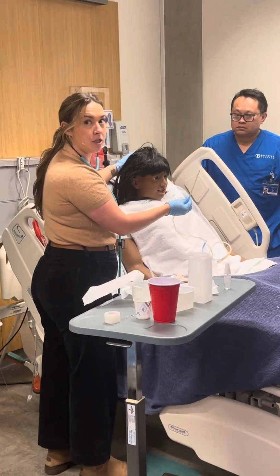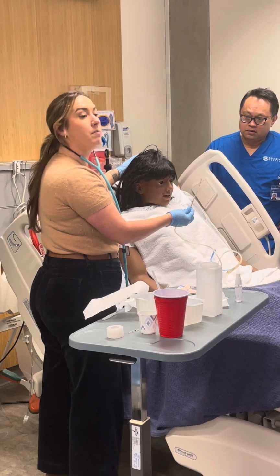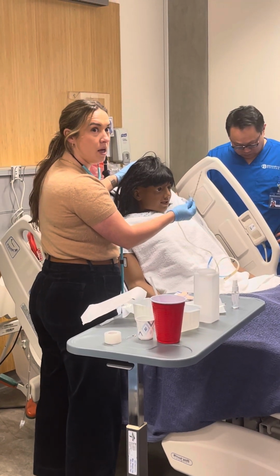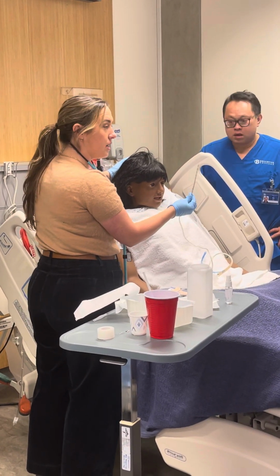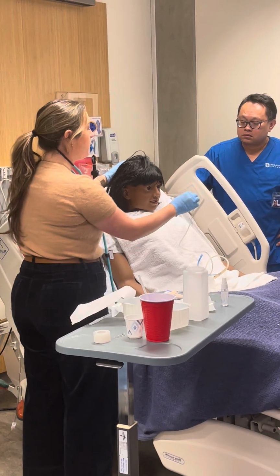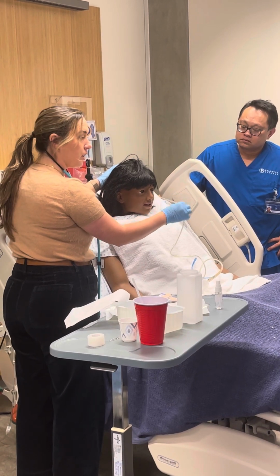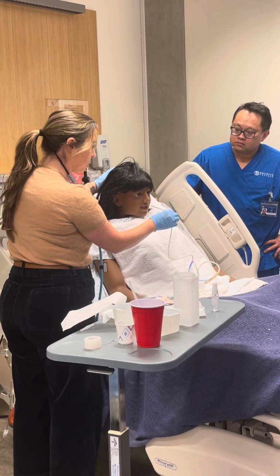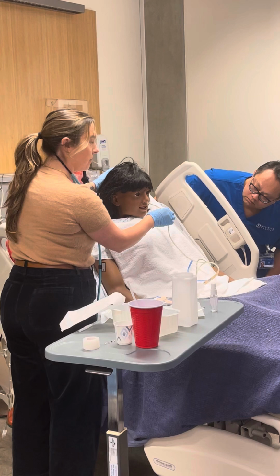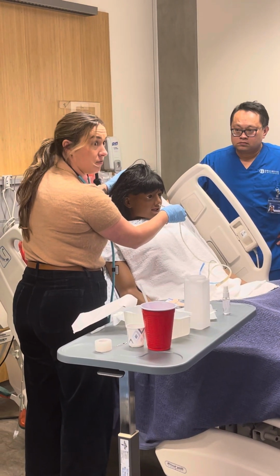Right, so I'll help them tuck their chin to their chest. When they tuck their chin to their chest, this helps them close their airway off and open up the esophagus. It's another way to prevent the NG tube from going into the trachea. So now I'm going to go at a straight back angle, like you're throwing a dart. Not up, straight back, just along the floor. Because remember that picture of the nasal passage, it's flat, right?